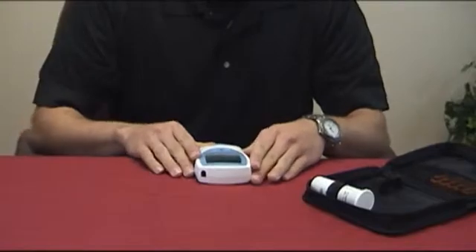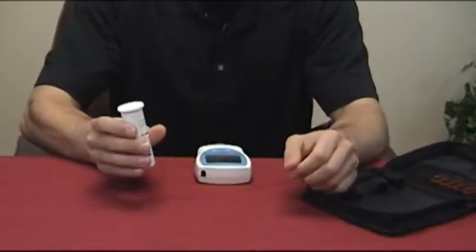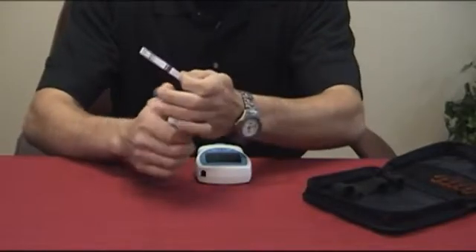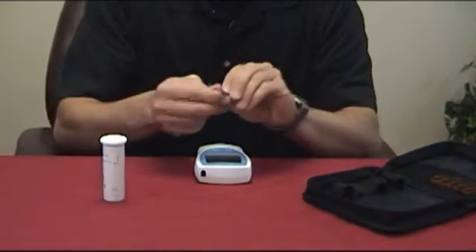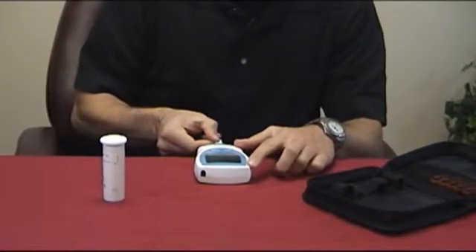Next, pull the meter to the edge of the table for easy access. When you take the test strip out of the vial, make sure to close the lid tightly, and simply insert the test strip into the meter with the arrows pointing towards the meter.